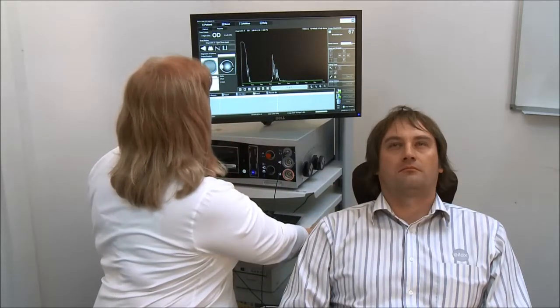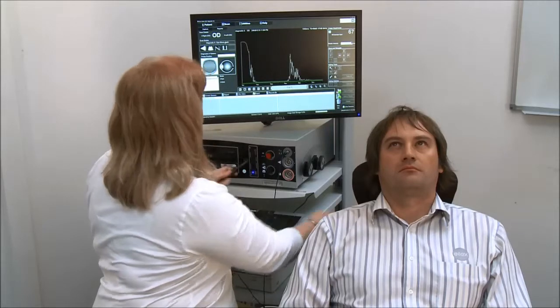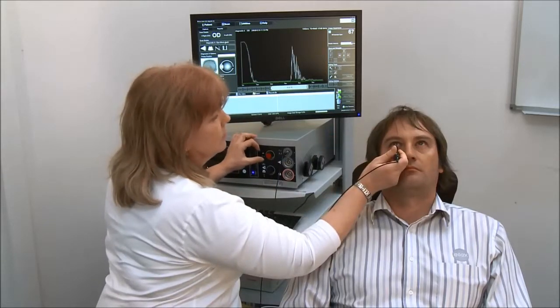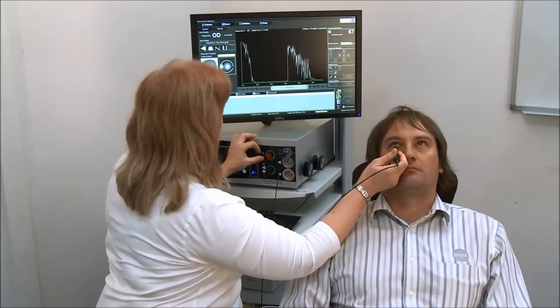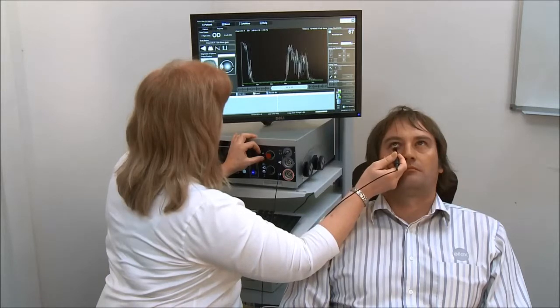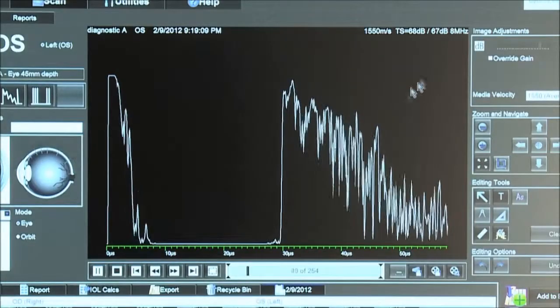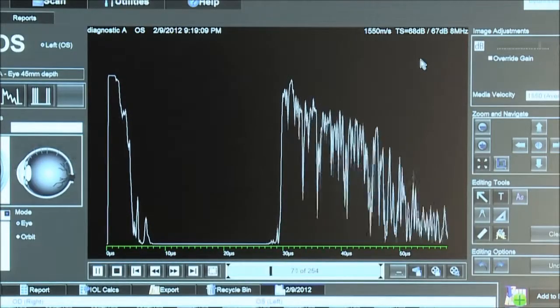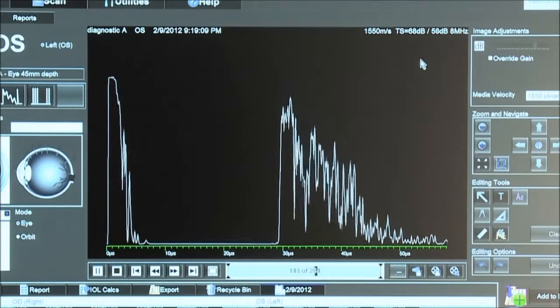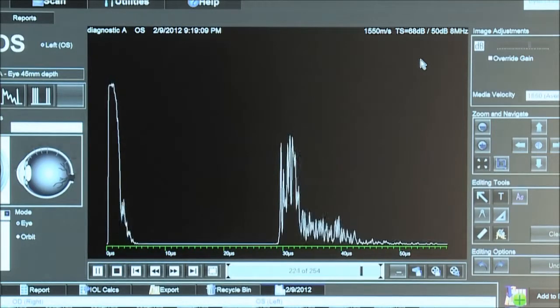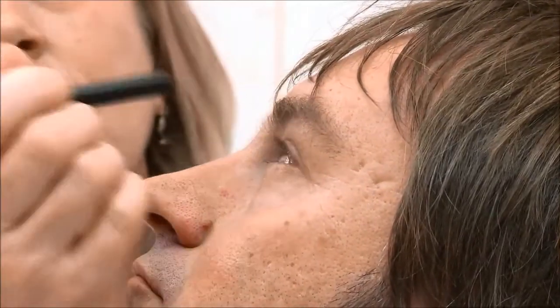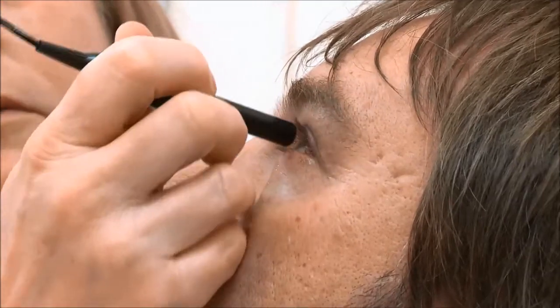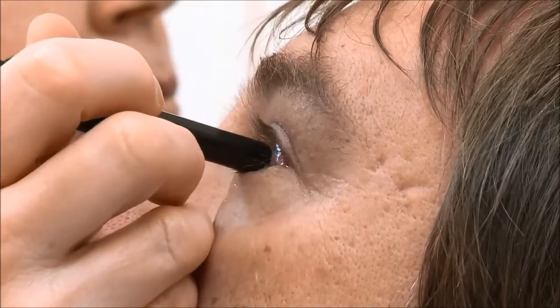Diagnostic A scan is generally performed after a B scan. If a lesion is detected on B scan, diagnostic A scan concentrates on this one area where a lesion has been found. It would not be necessary to perform a complete screening of every clock hour in order to determine an abnormality, as this has most likely been done with the B scan.